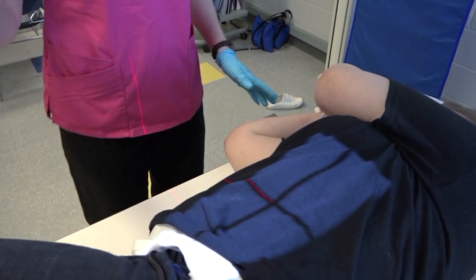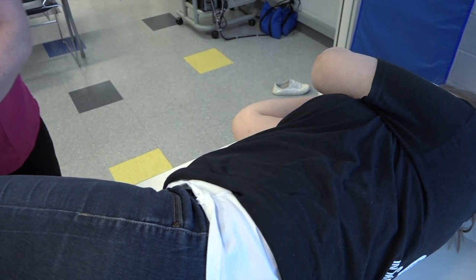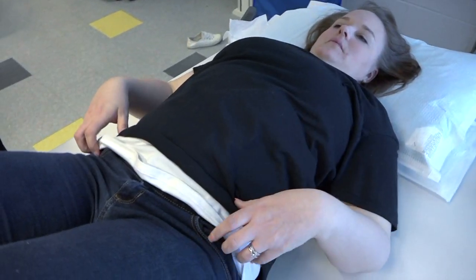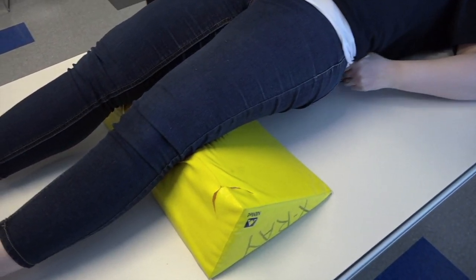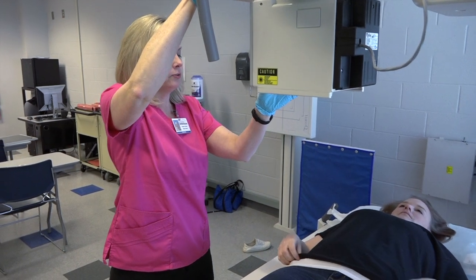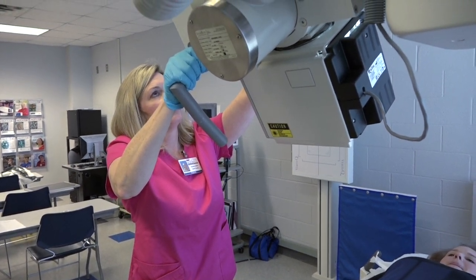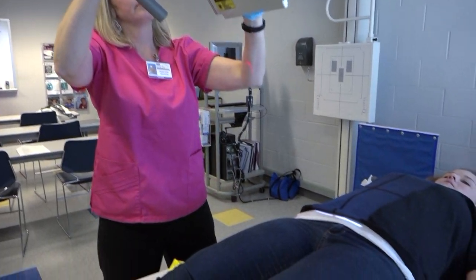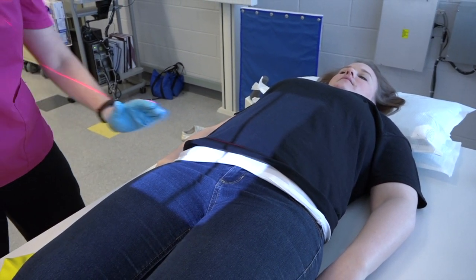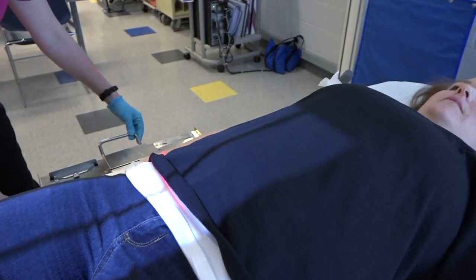Okay, so now we're going to go to our AP axial spot projection. So ask the patient to roll over on their back again. We can put the sponge under their legs. So this position is 30 to 35 degrees to the ASIS. So for females, it's 35. We're looking for the L5-S1 joint space.